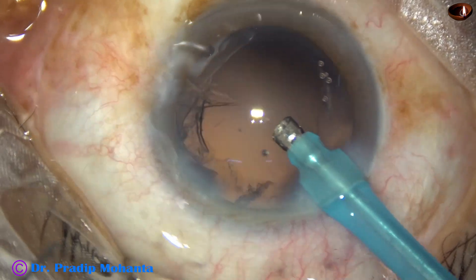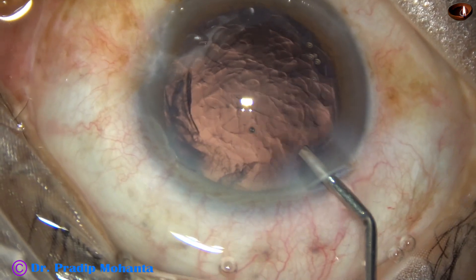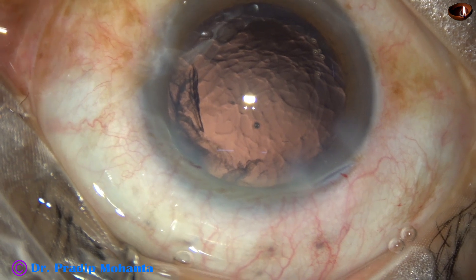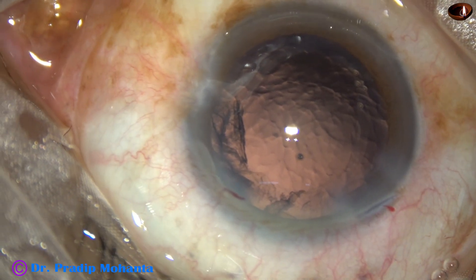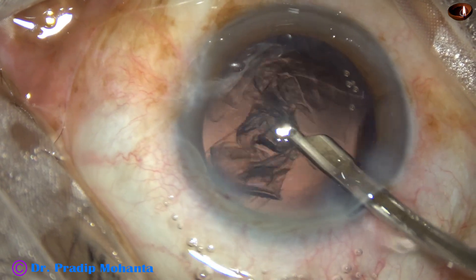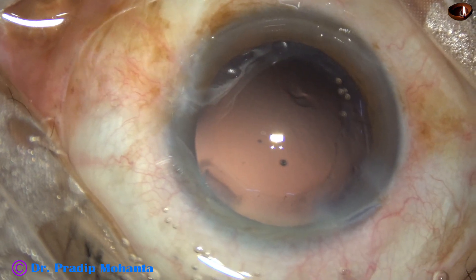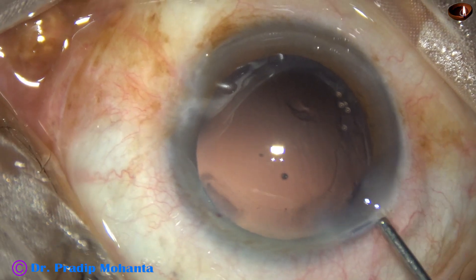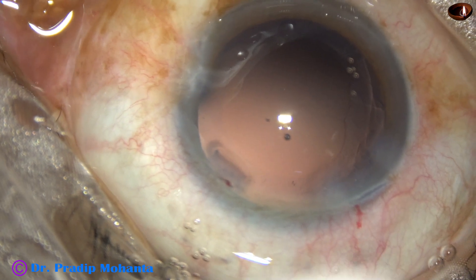In this case, we can see that the cortex is almost removed. This is because we rotated the nucleus clockwise and anticlockwise several times, so the cortex from 6 o'clock to 12 o'clock is already removed. Only the cortex on the left side from 12 o'clock to 6 o'clock remains. We can use bimanual IA, but this is not necessary for this small amount of cortex — we can easily remove it with a Simcoe cannula. Inject some visco in the anterior chamber and start aspirating. Let the other parts of the anterior chamber be filled with visco so that maintenance of the anterior chamber is good, you do not hit the corneal endothelium, and the anterior chamber does not collapse immediately.